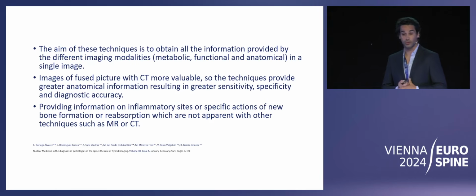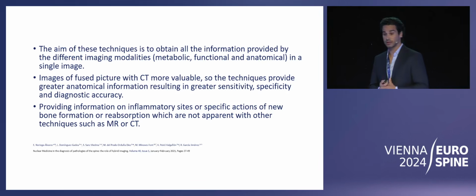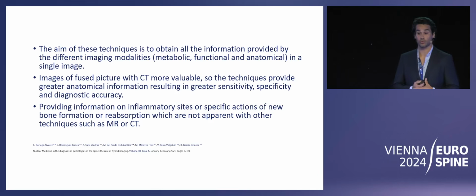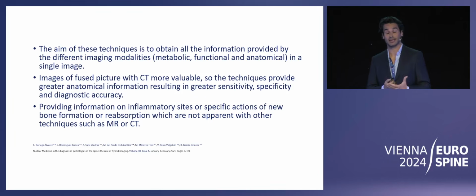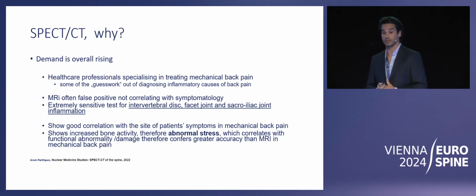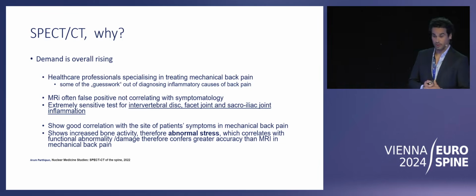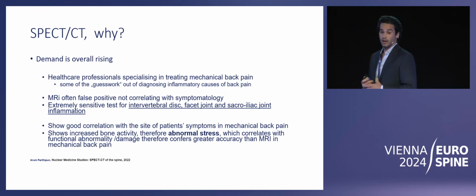They provide information on inflammatory sites or specific actions of new bone formation and reabsorption, which are not apparent on the other techniques such as MRI or CT. So let's come to the individual investigation methods.